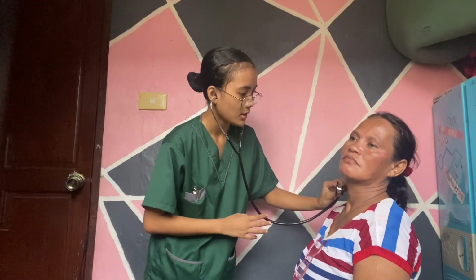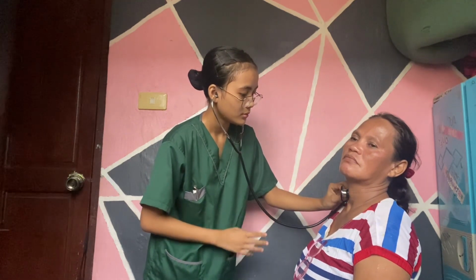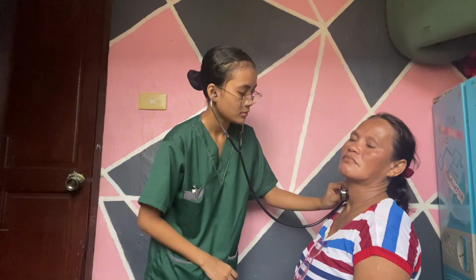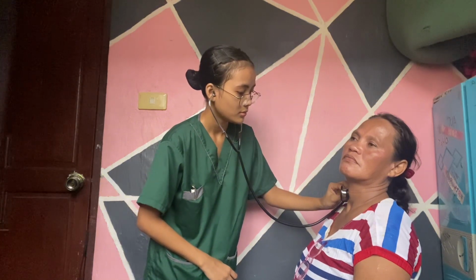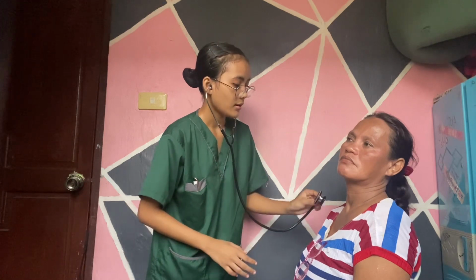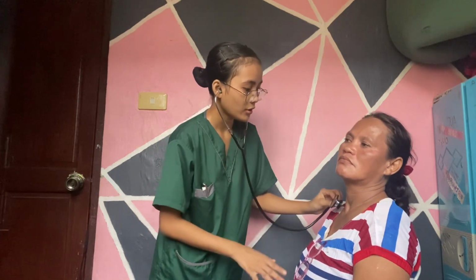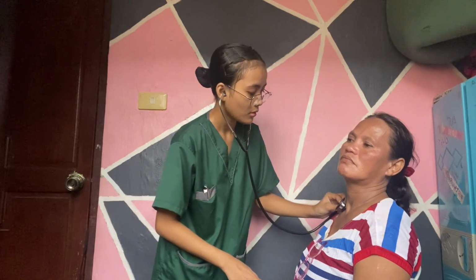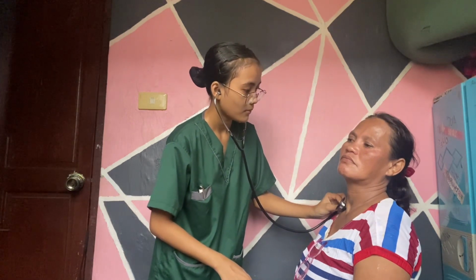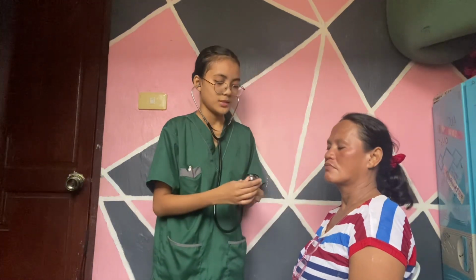So inhale, exhale, hold. Okay. Next is the base of the neck. Inhale, exhale, hold. Okay, that's good. So I do not hear any blowing or squishing.